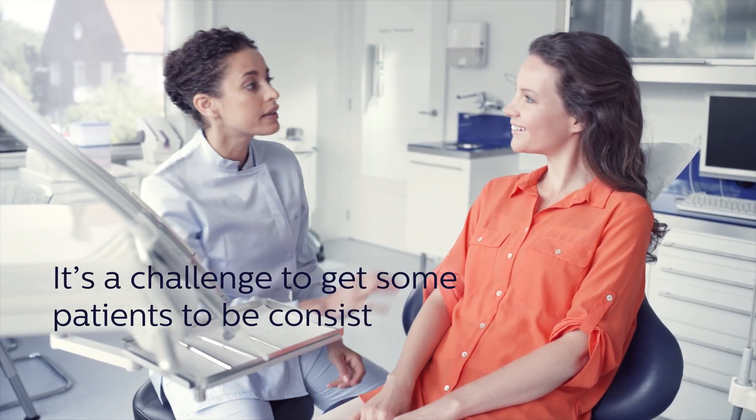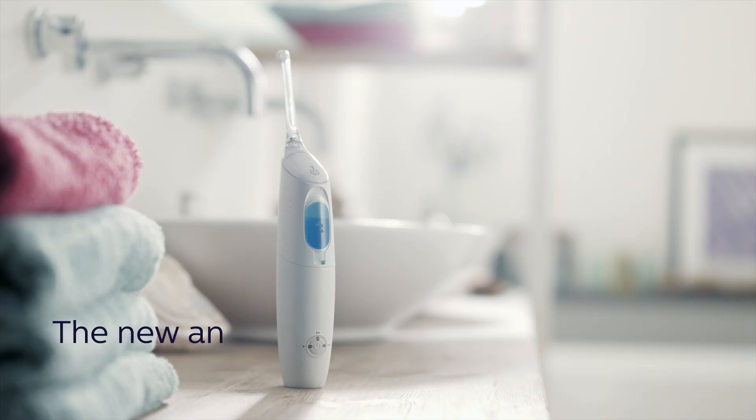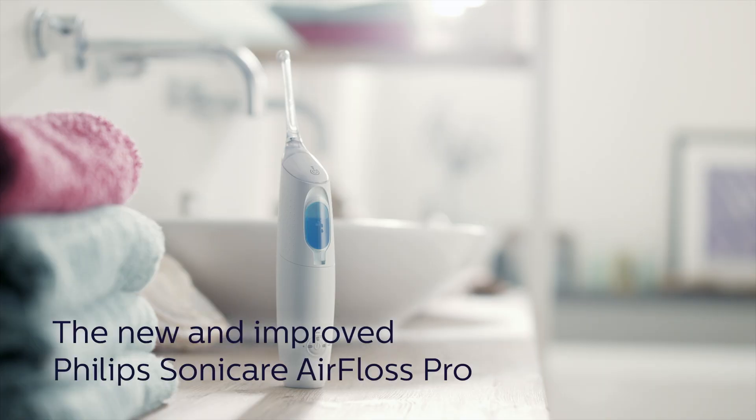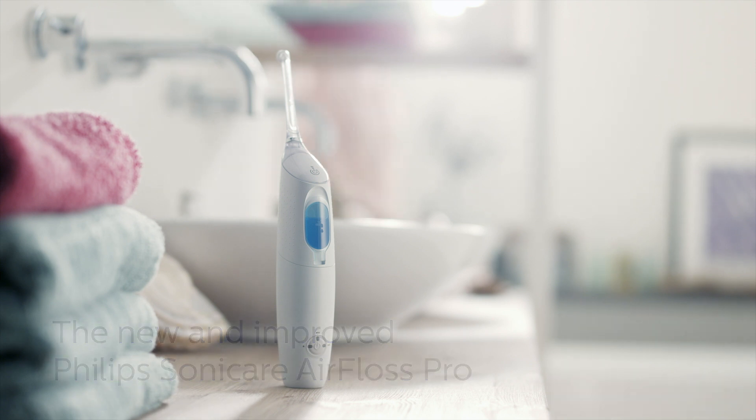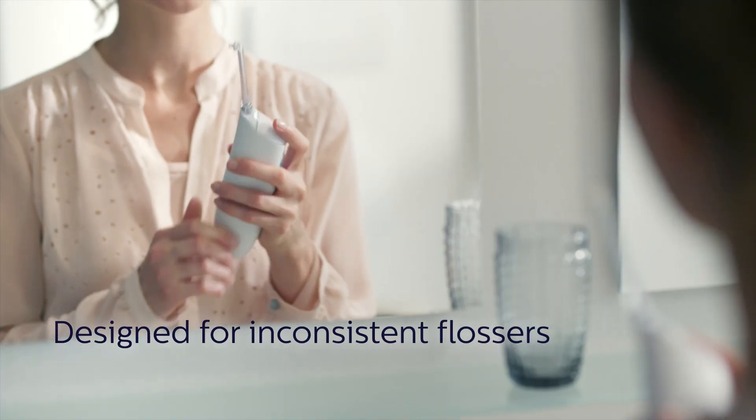It's a common problem: getting patients to adopt a consistent flossing routine. Until now! Introducing the new Philips Sonicare Air Floss Pro, an interdental cleaner designed to help inconsistent flossers improve their interproximal health.